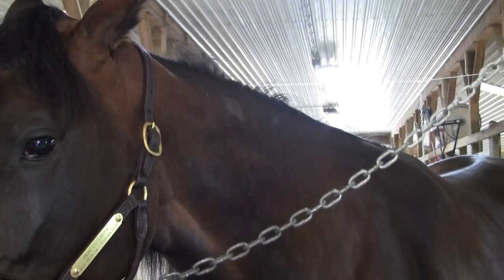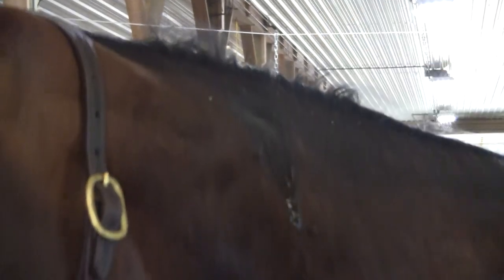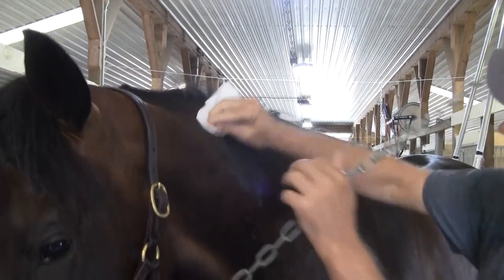We clip the slot. Now we're going to clean it — alcohol and a swab — just to make sure we don't have any complications. We want everything sterile.